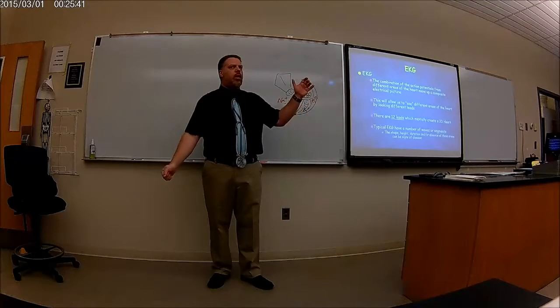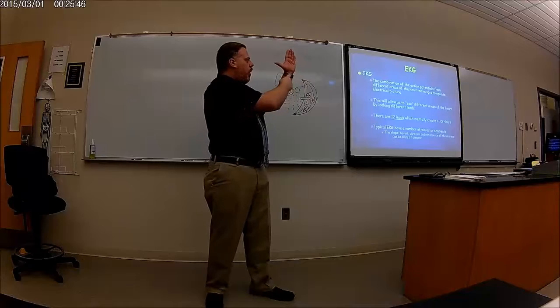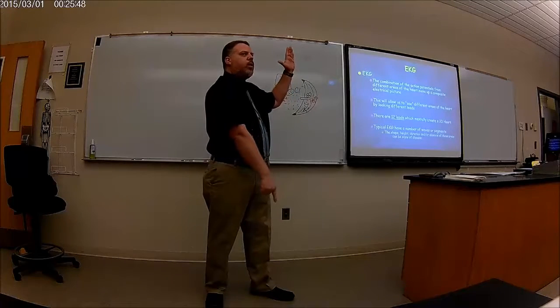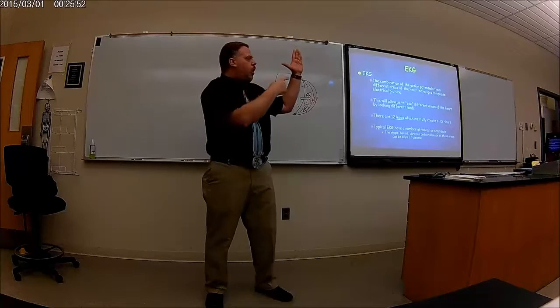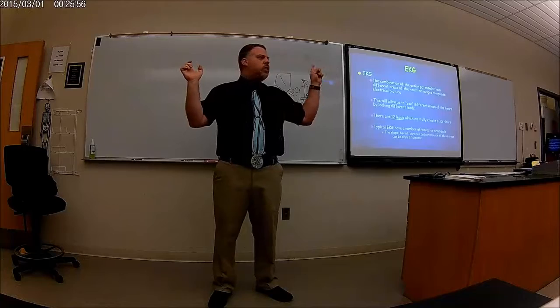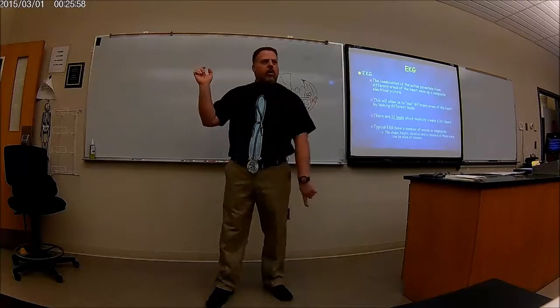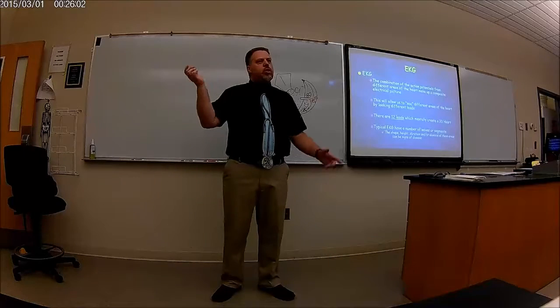There's only 3 here. Well, they sense the electricity through the heart from your wrist here to your ankle, and from your ankle to your wrist. There's 2. From this wrist to this wrist, that's 3. From this wrist to this wrist, that's 4. From this wrist to your ankle, that's 5. From the ankle to this wrist, that's 6. These are called the limb leads.